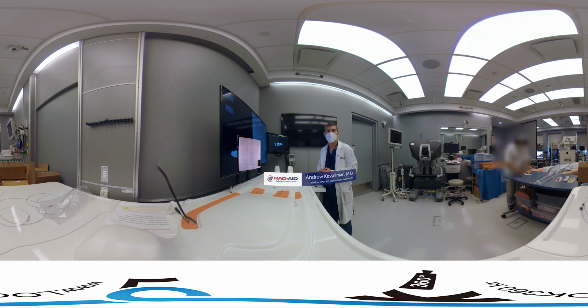Okay, so for this module, we're going to be doing a uterine artery embolization on the Mentis simulator. This is used for treating fibroids. It could also be used for treating postpartum hemorrhage in patients that are bleeding. So it's a useful procedure for those in low to middle income countries to learn using our simulator.